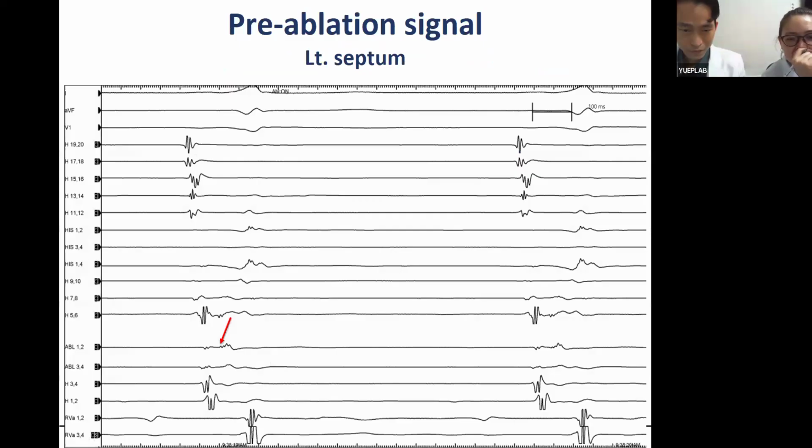Okay, take a look at it. Yeah, this is one successful ablation site there. There you go. Look at the signal. You got an A, and then you're probably targeting the ventricular insertion, maybe. But there's no Kent potential between. Okay? So look at the signal. And then you have a local A that is negative. So it really bothers me quite a bit.